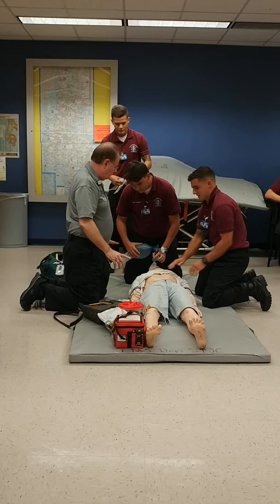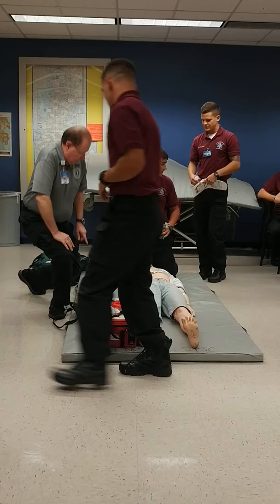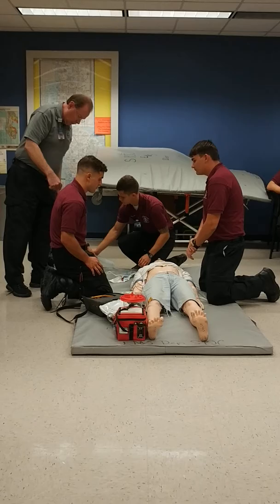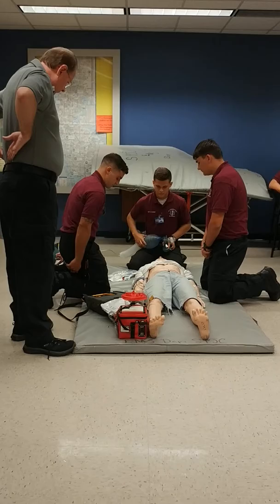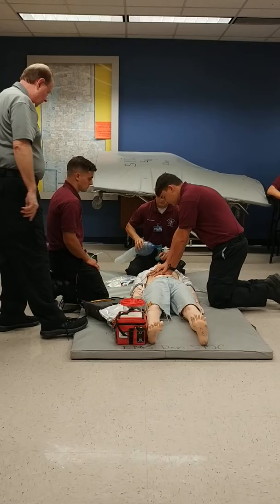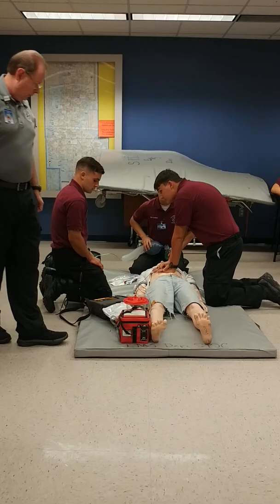Now it's time to rotate. Compressor goes to AED. Push analyze, stand clear, analyzing. Shock advised — back on compressions immediately, compressions only, no ventilation while charging.